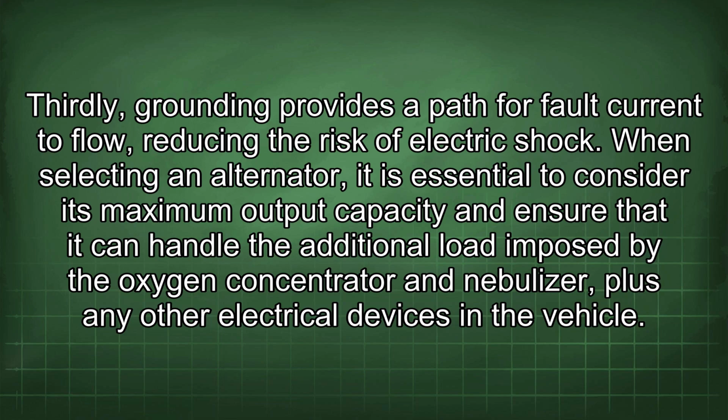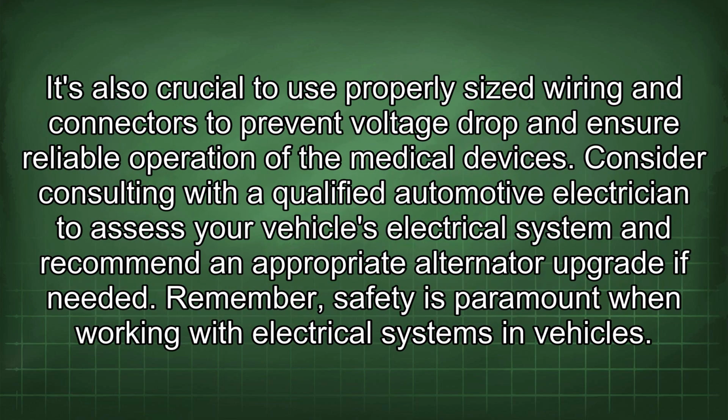When selecting an alternator, it is essential to consider its maximum output capacity and ensure that it can handle the additional load imposed by the oxygen concentrator and nebulizer, plus any other electrical devices in the vehicle. It's also crucial to use properly sized wiring and connectors to prevent voltage drop and ensure reliable operation of the medical devices.